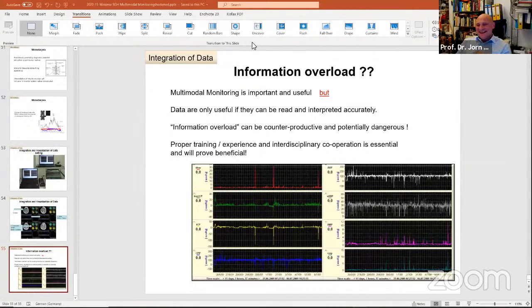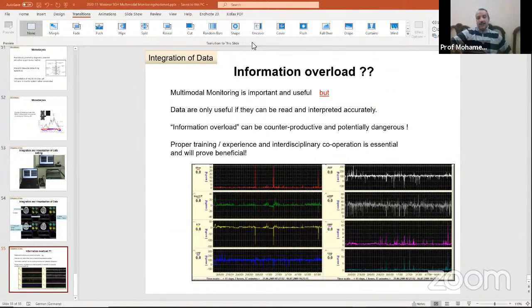I have a question for myself. Apart from trauma, if you are doing ETVs, endoscopic third ventriculostomy, for hydrocephalic patients after posterior fossa lesions, hematomas, or fourth ventricular tumors, when will you use an intraventricular ICP monitor at the end of the procedure? Do you use it, or do you just take out the endoscope and not put anything in the ventricles to monitor how successful it is?